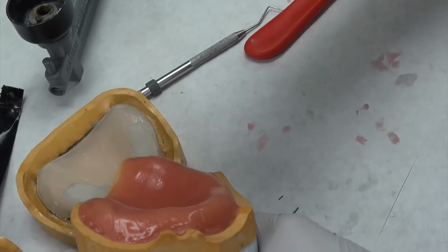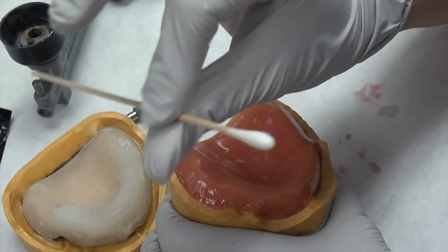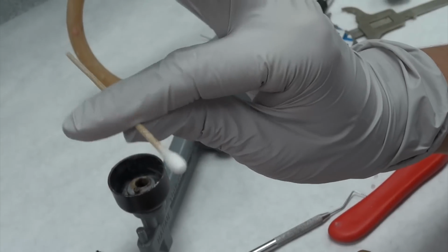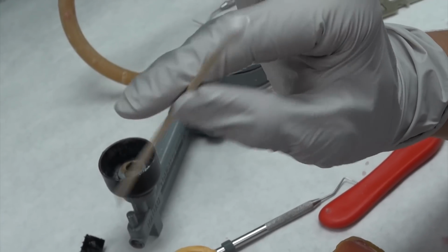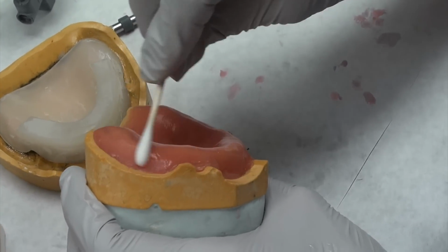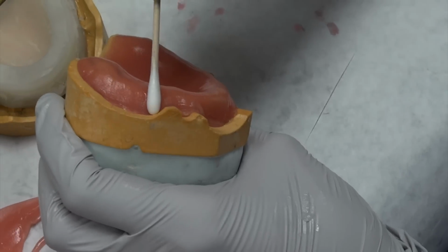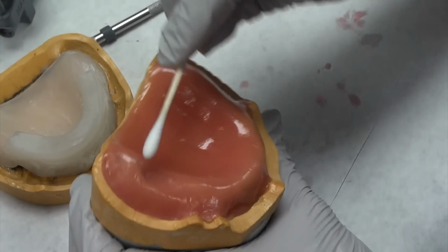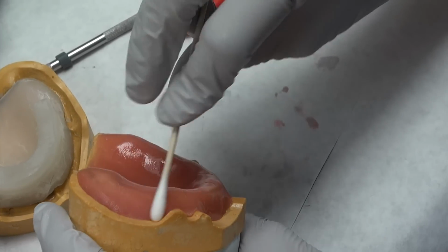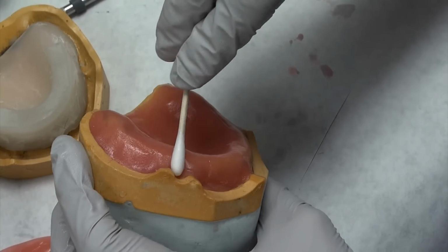Okay, so now with the Q-tip in your fingers, you're essentially going to be doing this back and forth motion. So using your index and your thumb, back and forth. Kind of practice that first, get the finger movement. Once you have that, see? Same thing, I'm using my other fingers to support it, but it's basically the index finger and your thumb that are actually doing the movement. The rest of the fingers are just supporting. See how smooth that is? Look how beautiful that is.